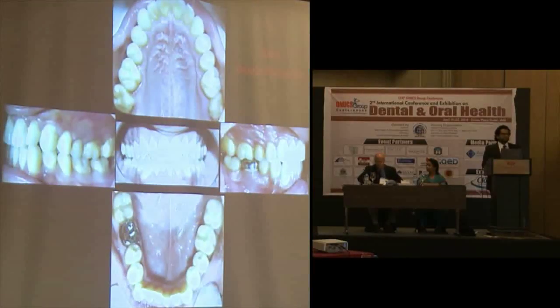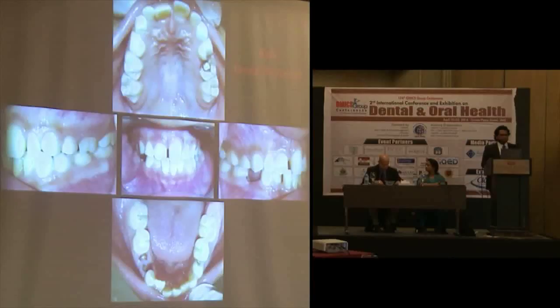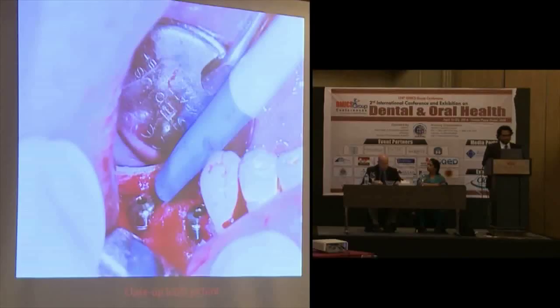Here is the basic dental photo set that we should take if we want to have a case to compare before and after. That's another example of a pediatric patient. And a third example. And that's an example of a close-up picture taken during a procedure.